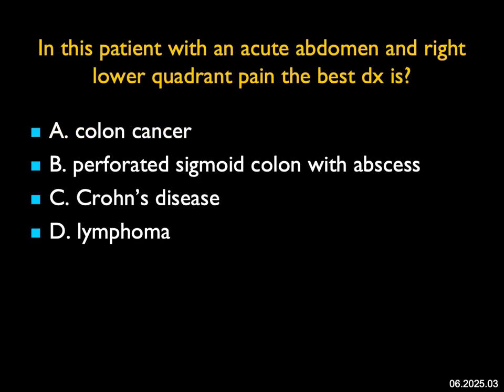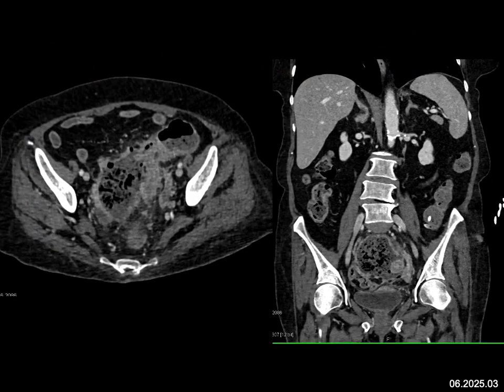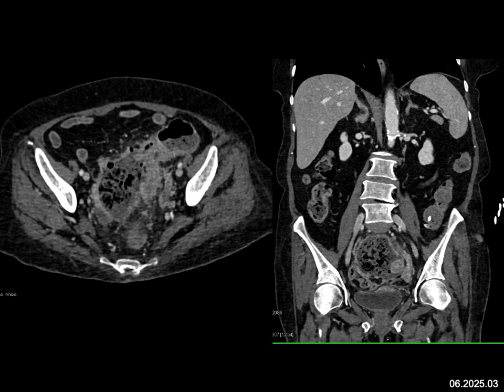In this patient with an acute abdomen and right lower quadrant pain, the best diagnosis: I see really thickened, inflamed sigmoid colon. I could not in theory exclude cancer. But then you see what looks like an outpouching of the wall to the right with a mottled collection with air bubbles and fluid. This looks like a big abscess with perforation. In theory it could be a colon cancer that perforated — I can't exclude that. It doesn't have the look of Crohn's disease infiltration. Lymphoma can involve the large bowel but usually would be bulkier, and I don't see other sites of disease. So the best answer statistically is perforation with abscess.